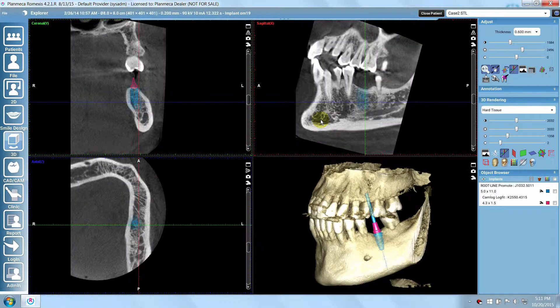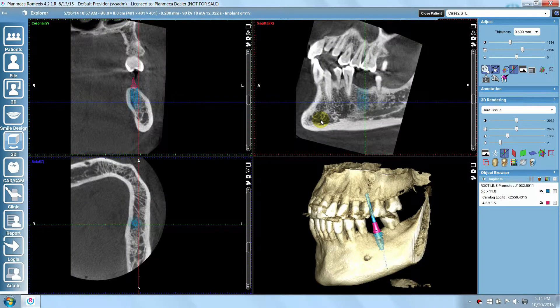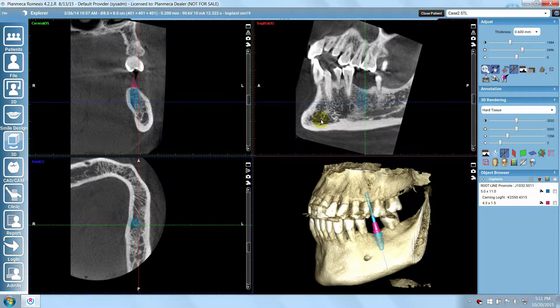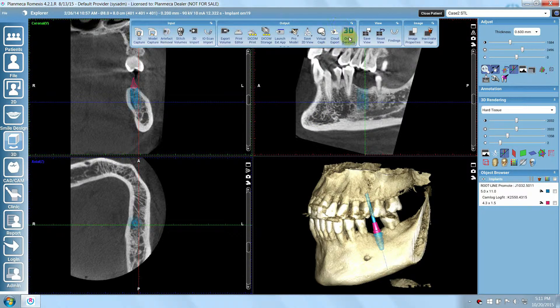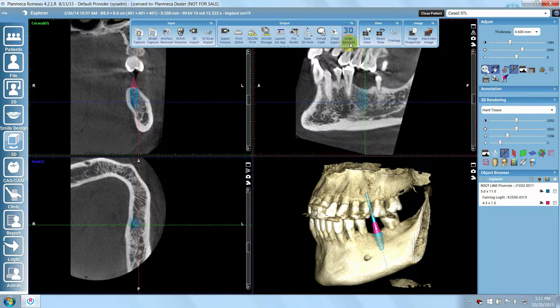Start the 3D-DX Order Service by clicking the 3D Order Services button from the top toolbar.